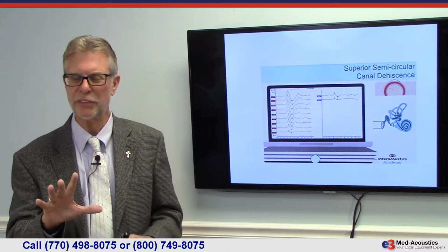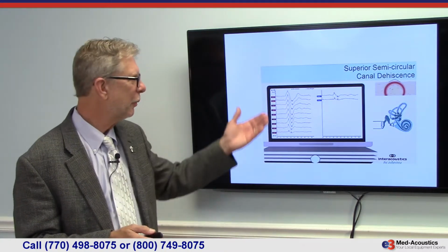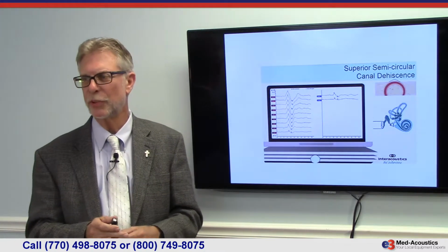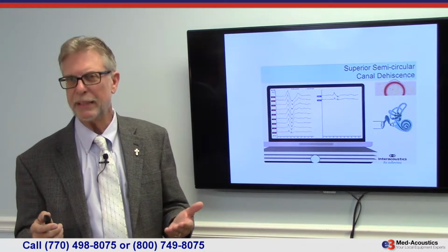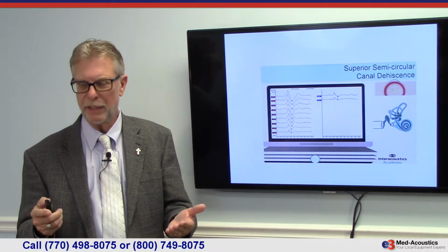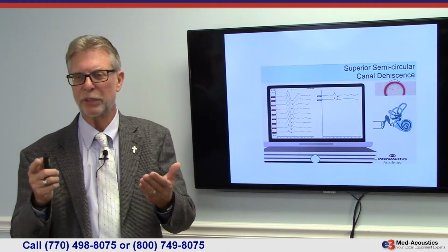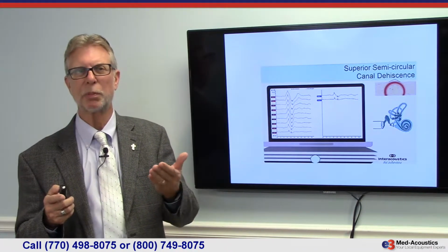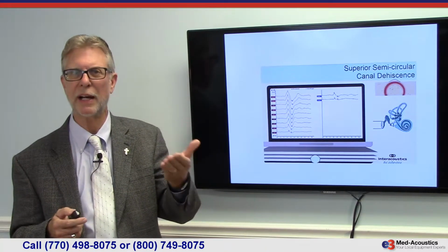Of course, you do have the patient's symptoms, but one way to find out is to simply do a search for threshold. And typically, in a normal patient, the CVEMP response is present at high intensities. It's certainly present at 100, it's present at 95.